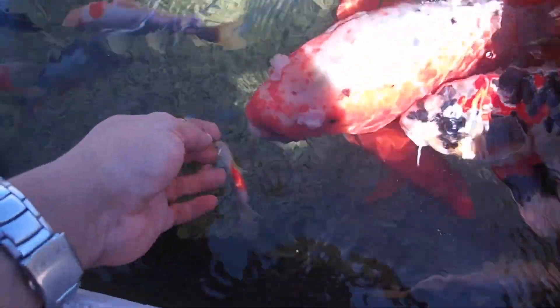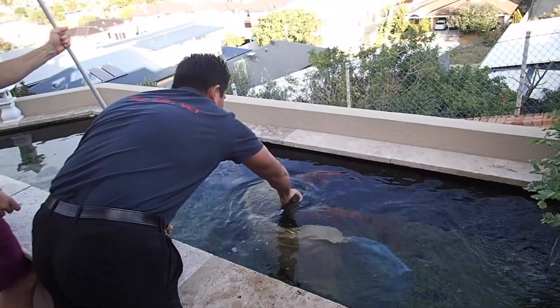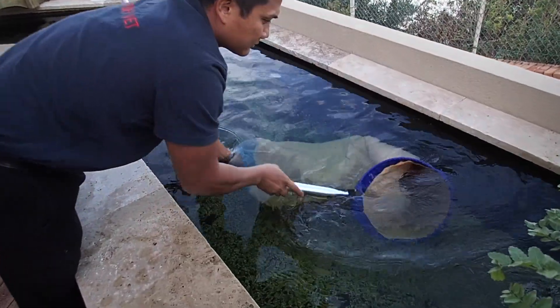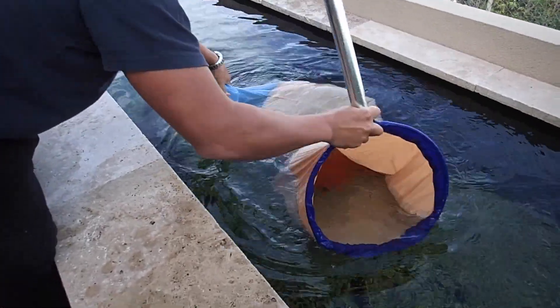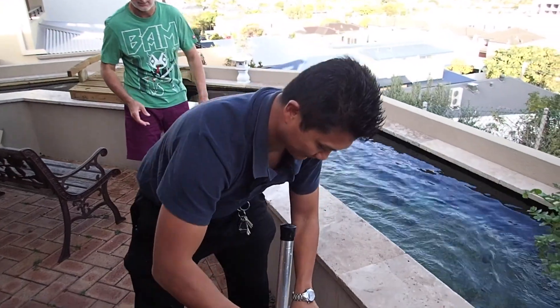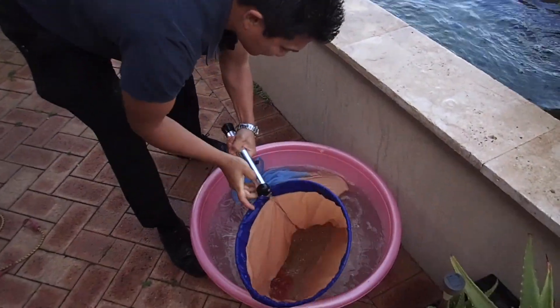Let's see, does he bite my finger? He usually does but he's a bit sore at the moment. He's nowhere near as friendly as he is. What we're doing here is transferring Harry, our koi fish patient, into an anaesthetic bath.